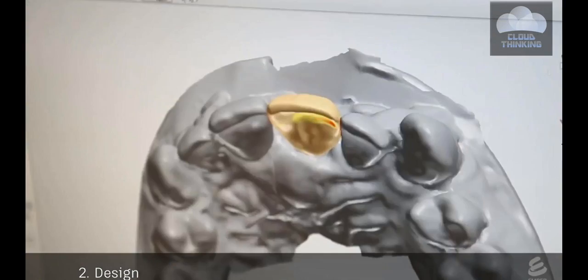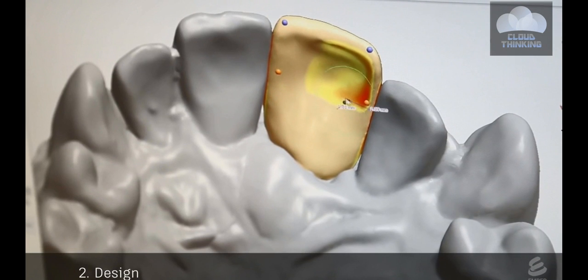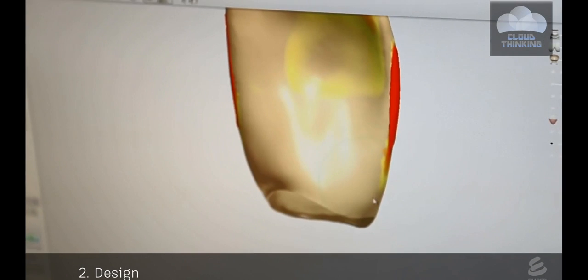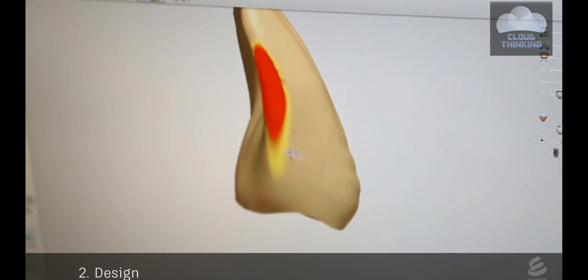The red regions indicate occlusions. This is where the model would collide with other teeth. The technician pushes and pulls on the mesh to make sure the tooth will fit.